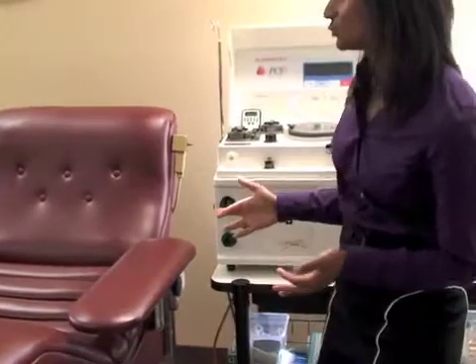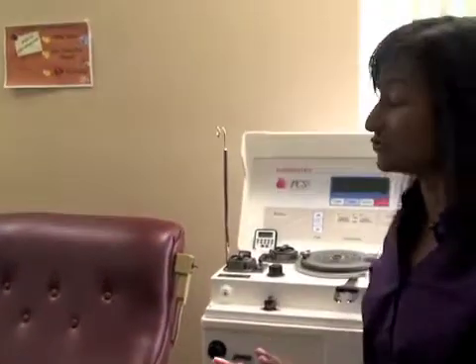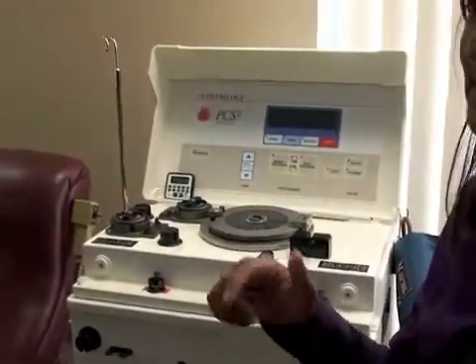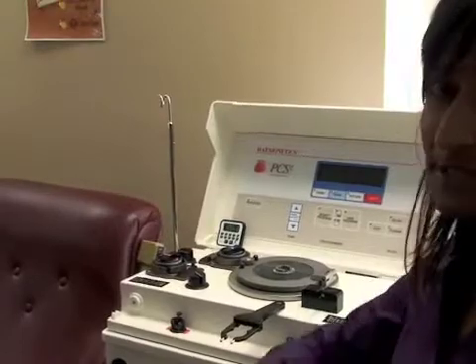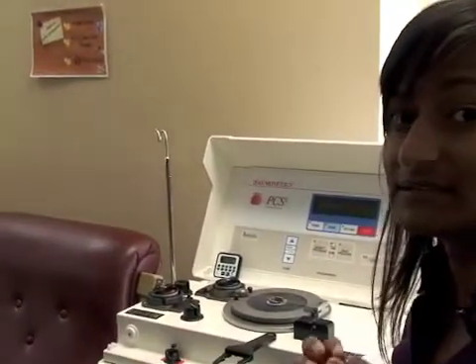Now, the way the donation works is you're swabbed, they insert the needle, the blood comes out, same as usual, but the blood gets put into this machine, which is called a centrifuge, and it spins really, really fast, and it separates out the part that we're taking, so the plasma or the platelets. And then the rest of your blood is returned to the donor's body. And because we're taking relatively a little bit, your body is able to replenish what we've taken a lot faster.